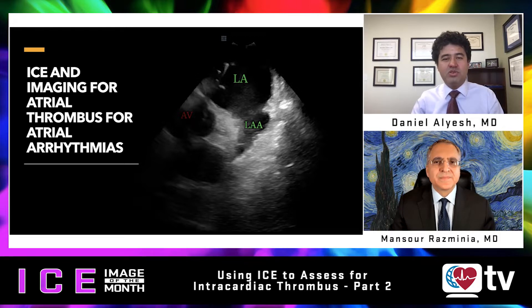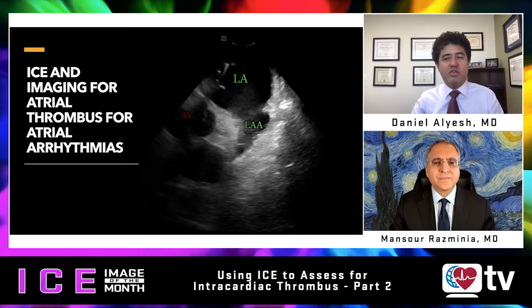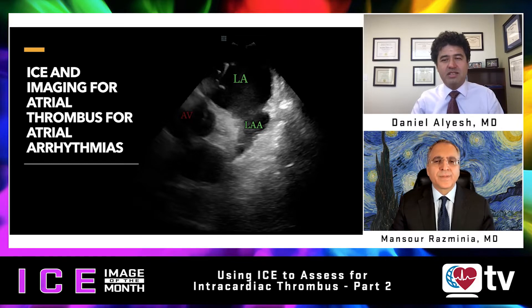This is part two of our episode of the ICE Image of the Month, where we focus on using ICE to rule out atrial thrombus in the setting of atrial arrhythmias. Part one covered the data around this practice and imaging using the ICE catheter from the RVOT as well as from the main pulmonary artery. Episode two will focus on imaging for atrial thrombus from the coronary sinus.